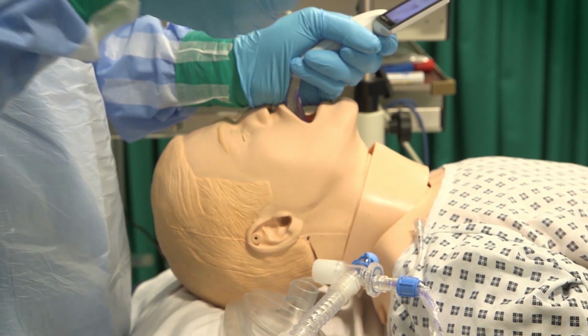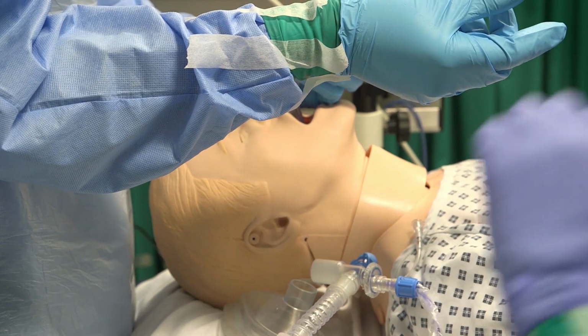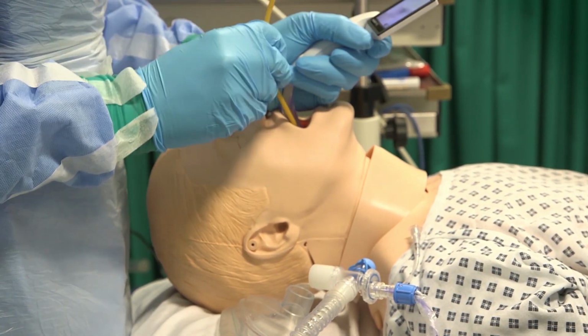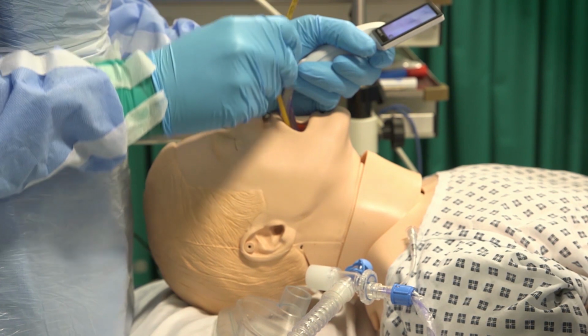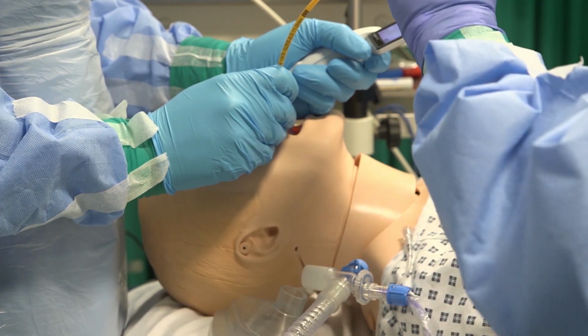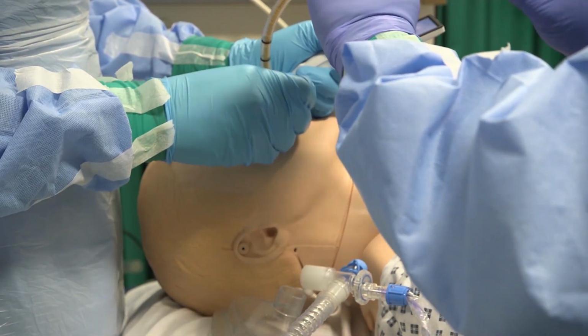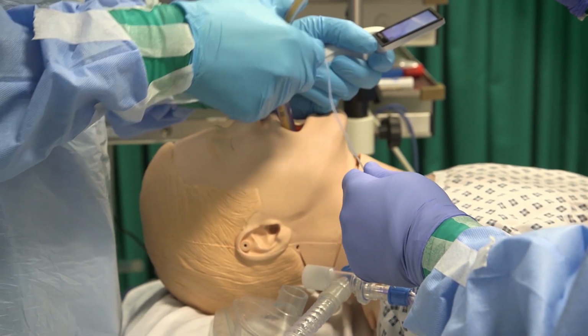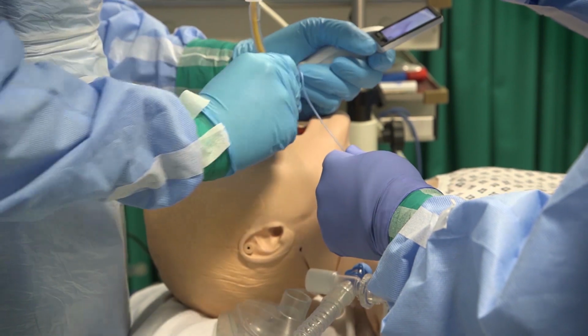Okay, so if I could have the video laryngoscope, please. Okay, and the bougie, please. Thank you. That's it. And the ET tube. Okay, have you got the bougie? Yep. Okay, tube in, so bougie out, please.